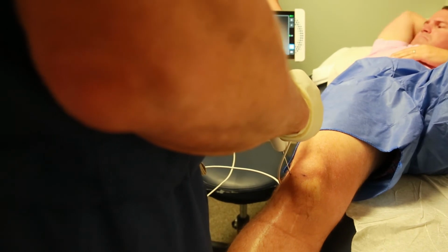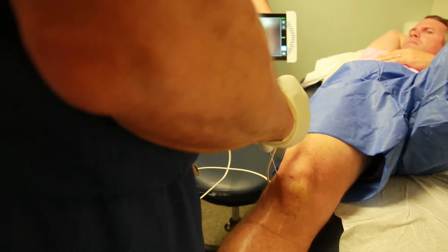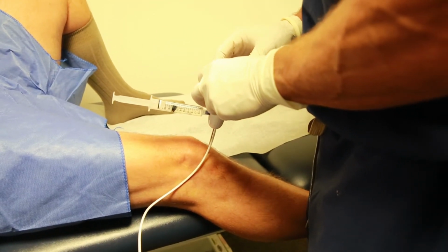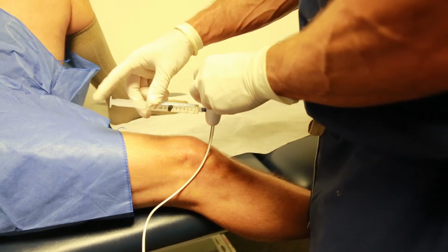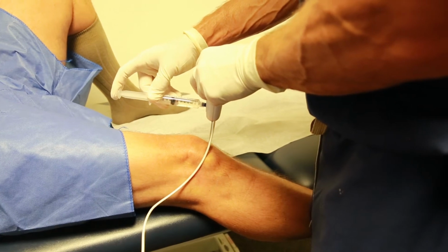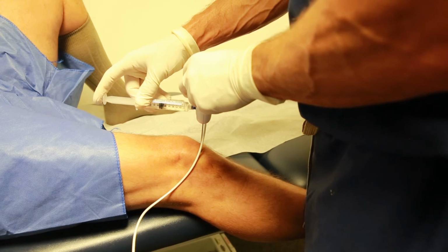I'm seeing the ACL scar, and now I'm getting over the lateral side of his knee. Take your time when you get here. Little movements will allow you to see things better. And we're getting his lateral compartment. So we're in your lateral compartment now, Jason. Okay, your condyle looks pretty good.